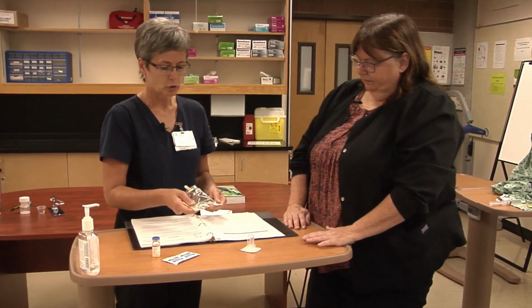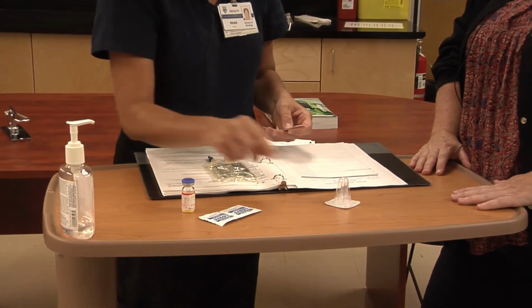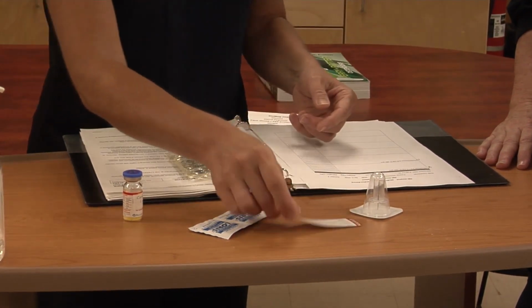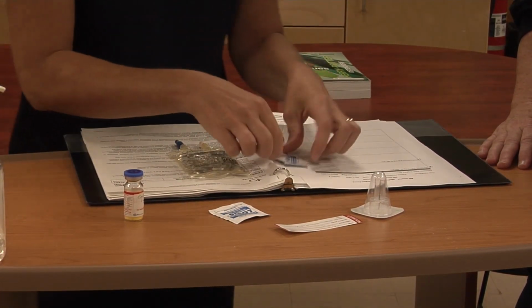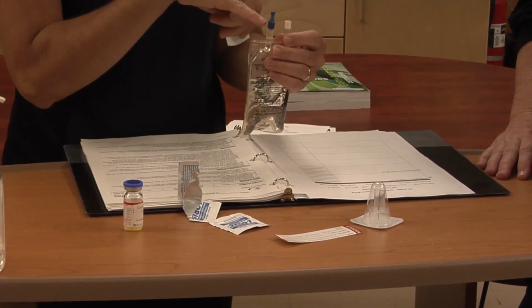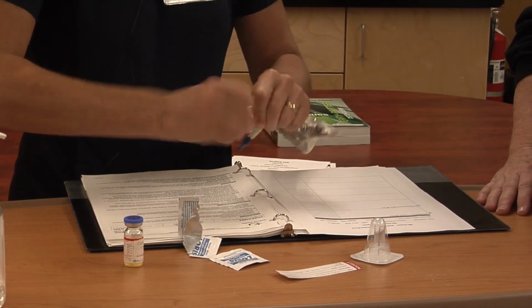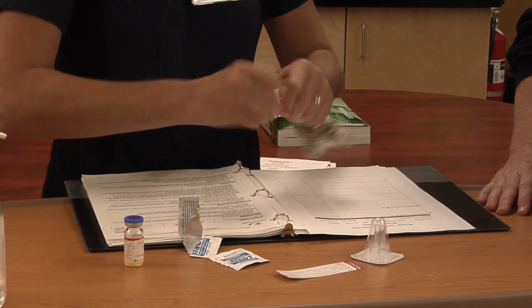Okay, so you've chosen your solution and your volume. You have something called a reconstitution device. You've got your medication and you've got some alcohol swabs. And I've already filled out my drug label. All right, done some hand hygiene. Okay, so there's two ports here. The blue one is the one that we're going to connect the IV tubing into, and the other port is the one we're going to access for the medications.